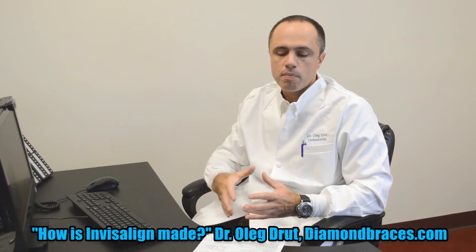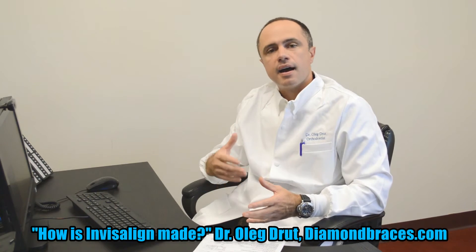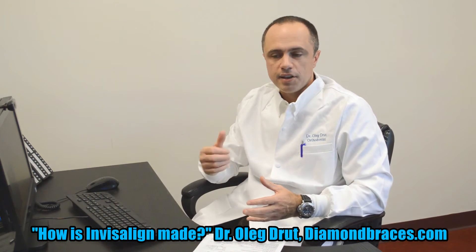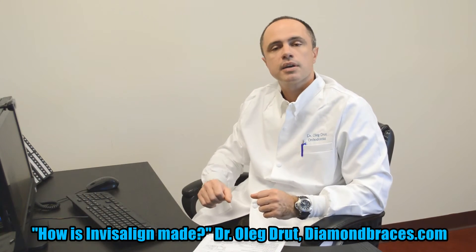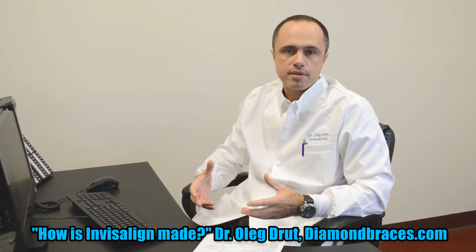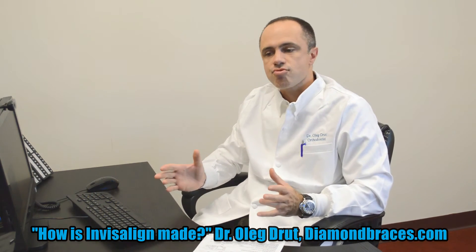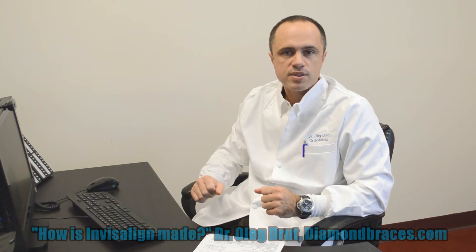The technicians will make a series of trays depending on the situation with your teeth — sometimes 20, 30, or 40 trays, depending on how much movement is needed. Those trays will be cut by a 3D printer, and that's how they're made. The trays are then sent to the doctor's office, and that's how they will start the case. Thank you very much, have a nice day.